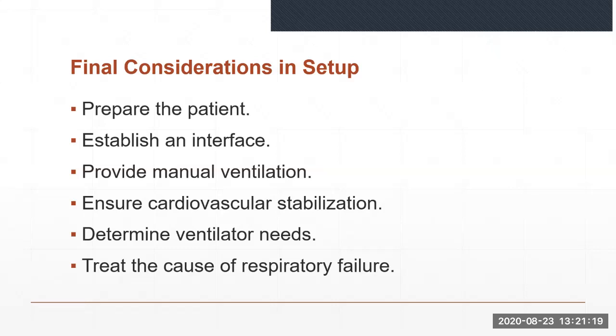Before initiating mechanical ventilation, the patient's ventilatory requirements can be supported by using a manual resuscitation bag. These devices are easy to operate and allow the clinician to monitor closely the patient's breathing efforts and changes in airway resistance or lung compliance.